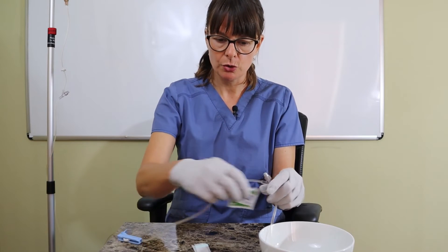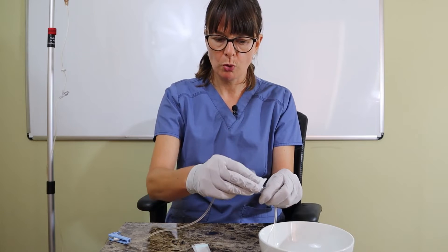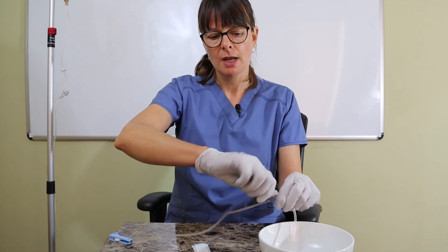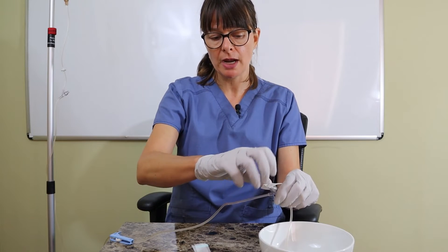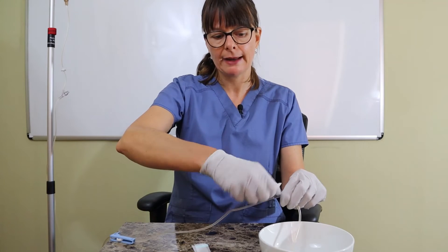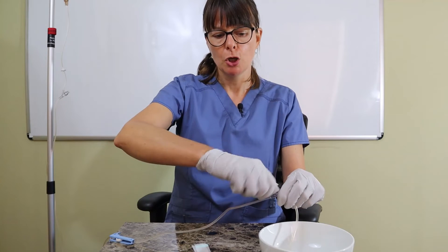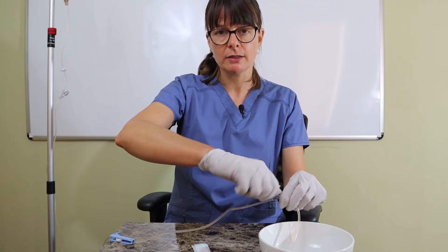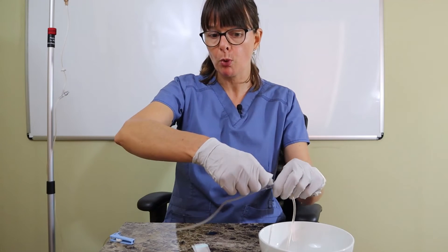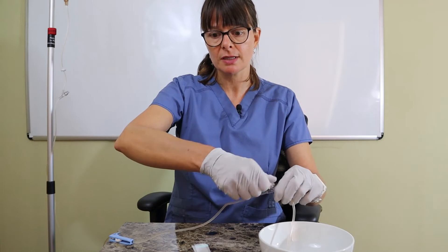Now I'll use my alcohol pad and swab this port for at least 10 to 15 seconds vigorously, because this port is otherwise exposed to the air. Patients have all kinds of visitors coming in and out; they might drag this part of the port in the bed because it's closest to their IV site. We want to make sure we clean this vigorously so that we don't push any germs from the port directly into the patient's bloodstream. Aseptic technique here is key.